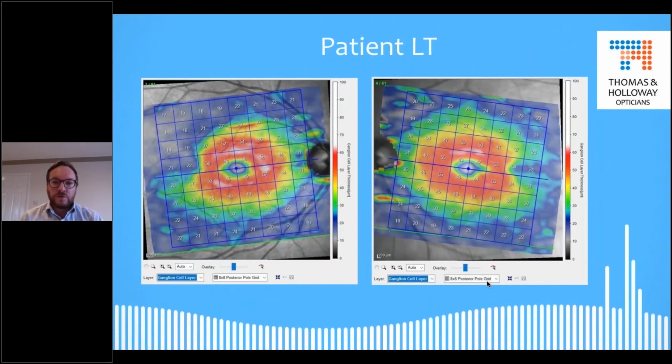On the face of it, don't look too bad. You've got a full red circle there with some white peaks. However, when you look at the appearance, you can see here this almost step in the GCL here, with the thinning arc coming back from that point up into the optic nerve head, particularly when you compare it to the inferior. So again, whilst there is a complete ring of red, and you could say, well, it looks like a bullseye, it's not an even bullseye, and we do definitely have some clipping of the ganglion cell layer in that area just there.